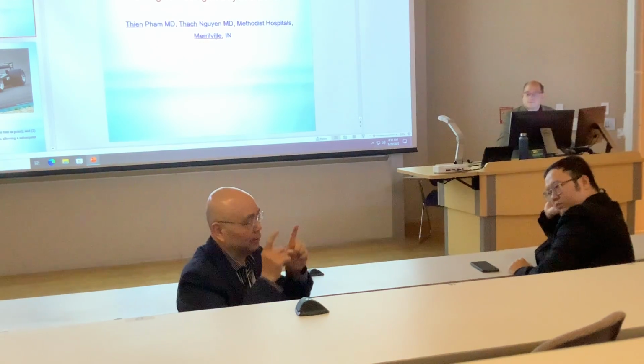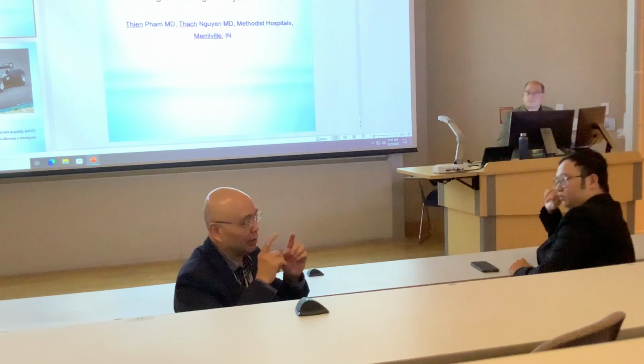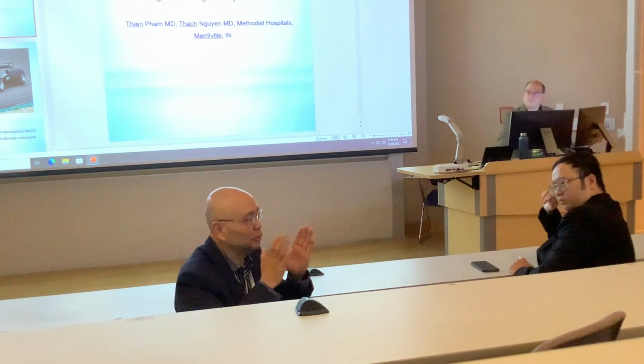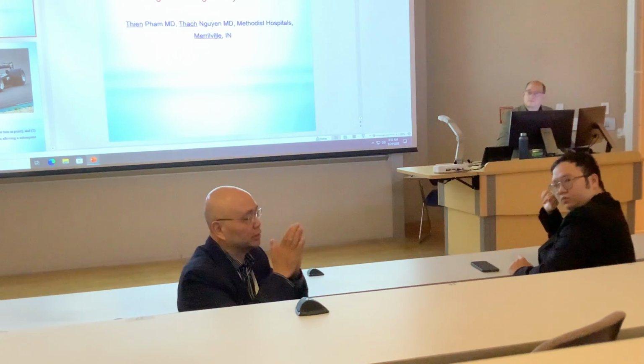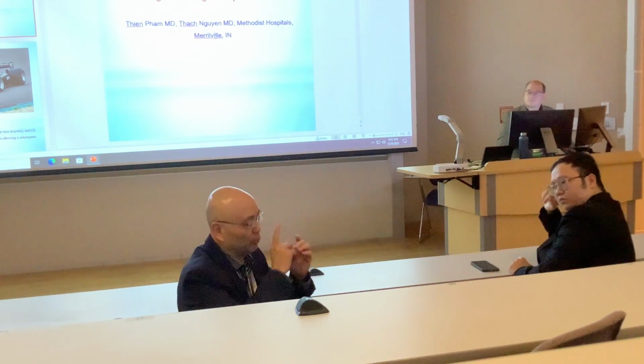It will cause blood clot, thrombosis, thrombus, and cause the occlusion of the stent. So when we expand the stent, we expand more than usual to be sure the strut of the stent touches clearly at the wall. So number one.